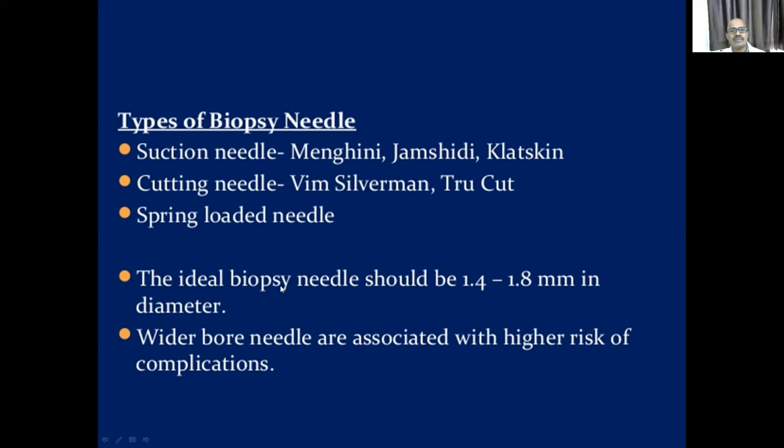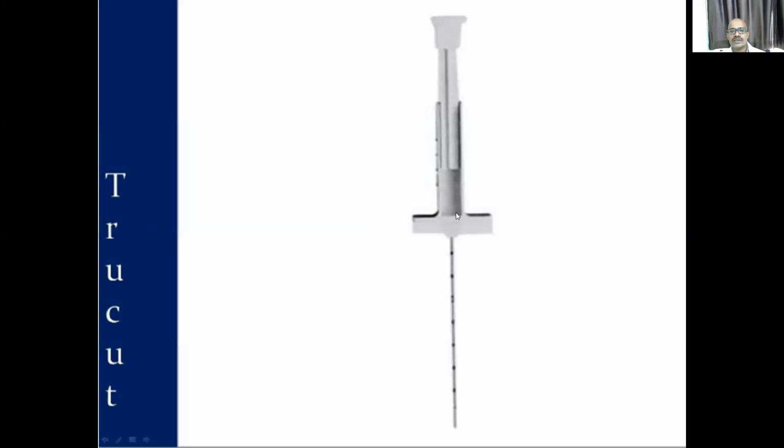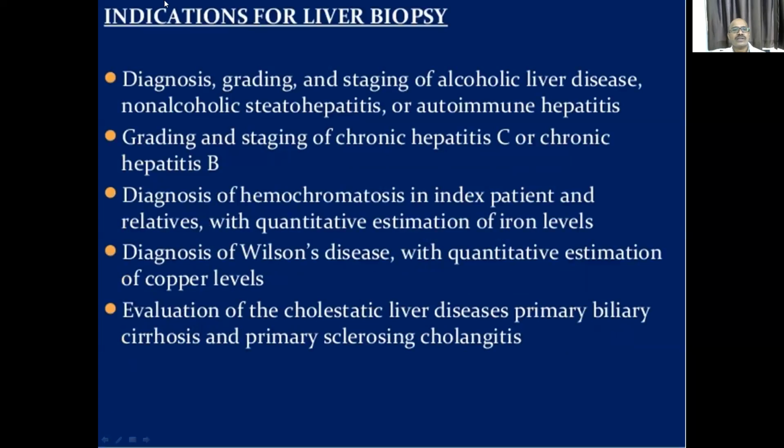The ideal biopsy needle should be 1.4 to 1.8 millimeters in diameter. Wider bore needles are associated with a higher risk of complications. So the needle is the Vim-Silverman liver biopsy needle. The initial figures which I have shown are the liver biopsy needle.